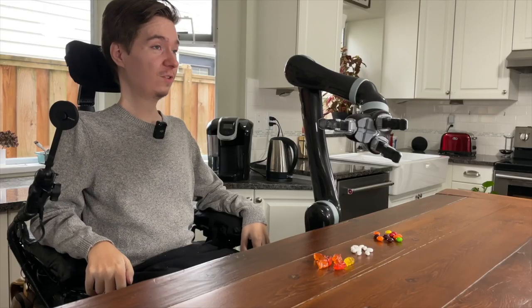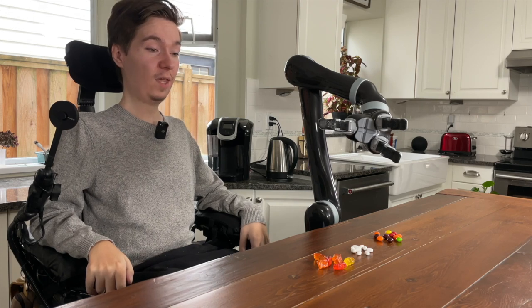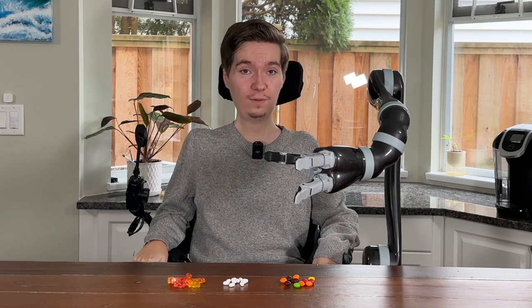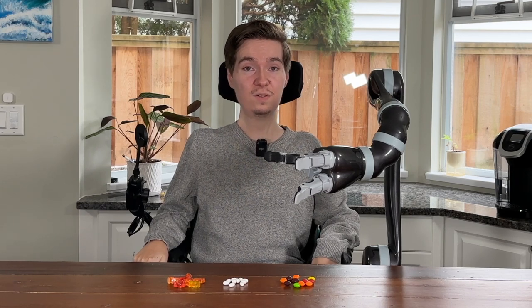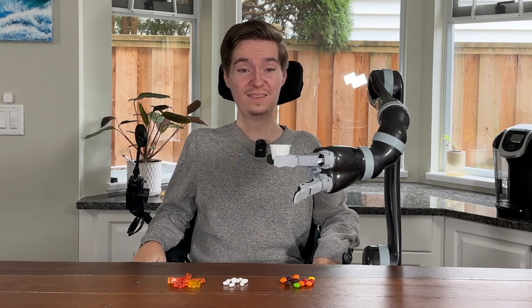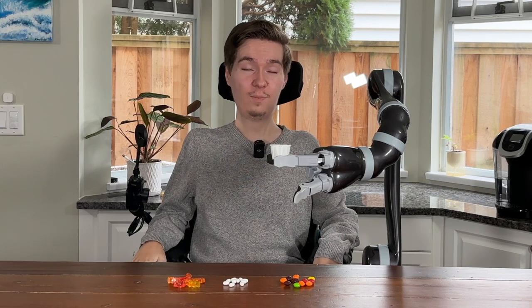There are two methods that I personally use to take my own medication. One is by picking the pills up one by one and just inserting them into my mouth. The second way is using some sort of container or vessel. My personal preference is using paper cups, like this one. A great way to start, though, is just picking the pills up one by one and putting them into your mouth.